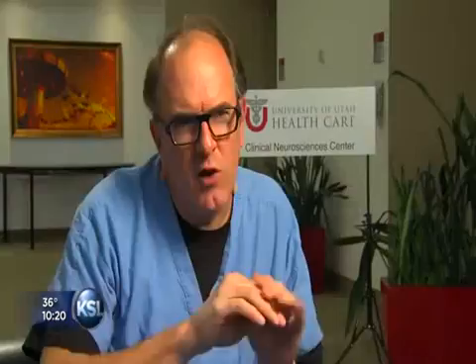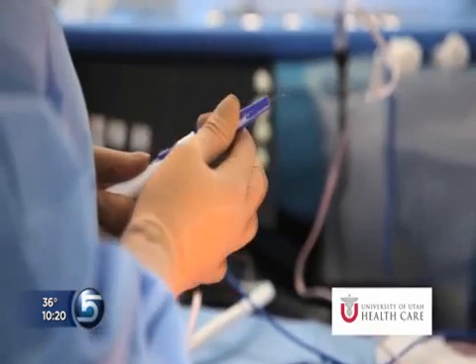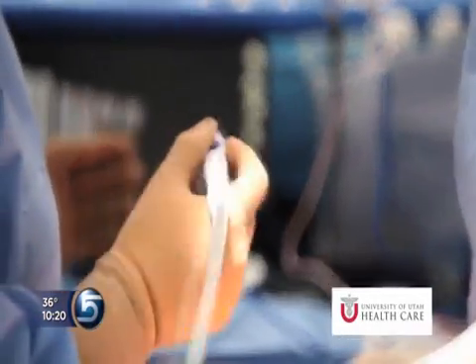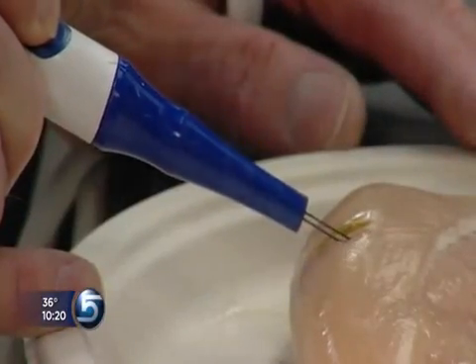These are areas where you need a lot of precision and a lot of dexterity to the instrument, and you don't want a lot of heat spreading in untoward directions. Unlike current electrosurgical tools, the paper clip-like tip on the end of the wand is coated with a special alloy that creates a magnetic field. The tool produces a pure heat that instantly turns on and off at the surgeon's command. In this demo on grocery chicken meat, no electricity passes through the body.